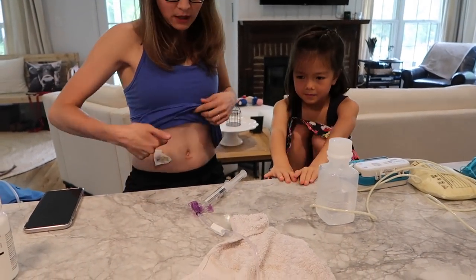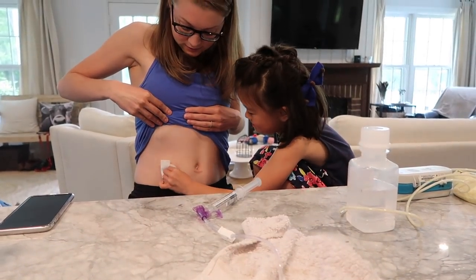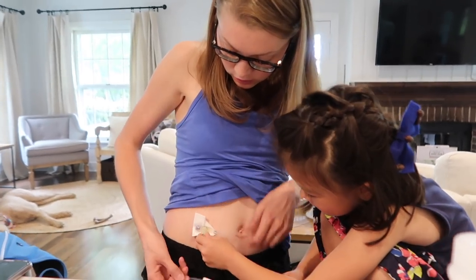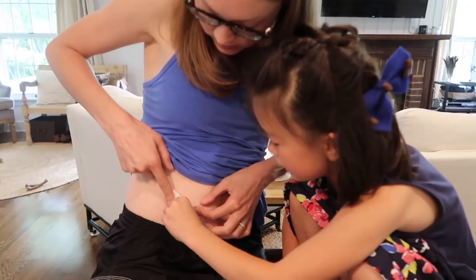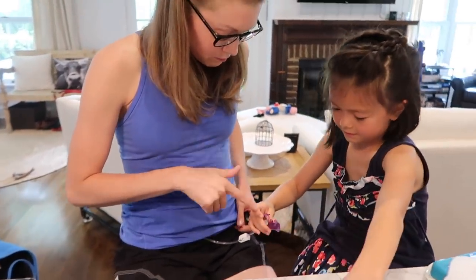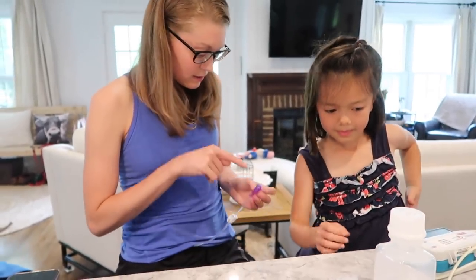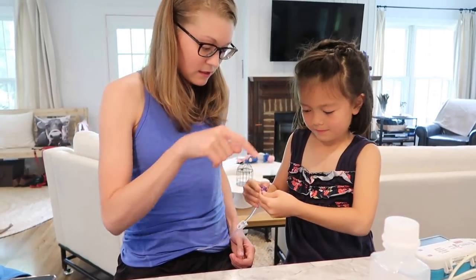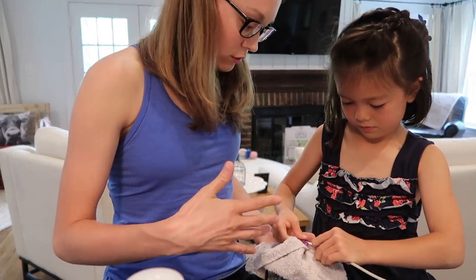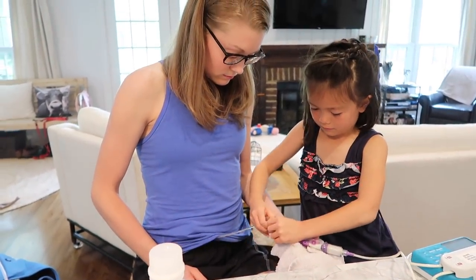Okay, then we're going to hook that up to me. So what do we have to do here? First of all, you open this. Didn't come out — yay! Yay, didn't explode — that's always good. So line the two notches up, there you go. Now twist. Good. And then clamp. And then take that off. Plug that hole before anything comes out. Then you can open the big hole, and then run. And you want to push that white thing in — pretty hard. Yep, good. And then unclamp this. And then push run.